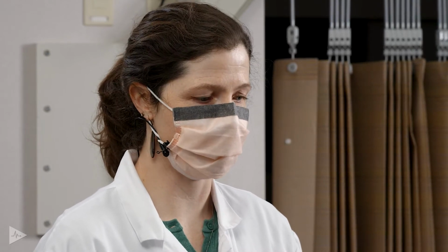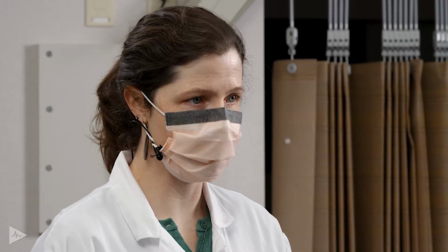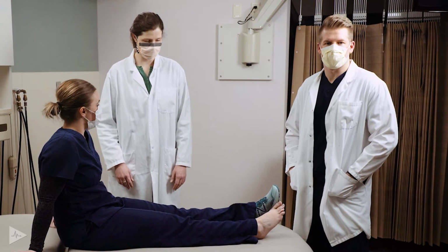For cast management, we generally will apply the first cast and then change that between 2 and 3 days later, as the cast will reduce swelling in the extremity. After that initial change, then we usually go to weekly or twice weekly changes depending on how much exudate we have from the ulceration. Once the ulcer has healed, we will continue casting for 1 to 2 weeks after that to reduce the risk of recurrence and allow the newly healed tissue to mature. If we are casting for a Charcot-arthropathy, then casting can be stretched out to 2-week intervals instead of once a week. So we will begin the demonstration for the total contact cast now.